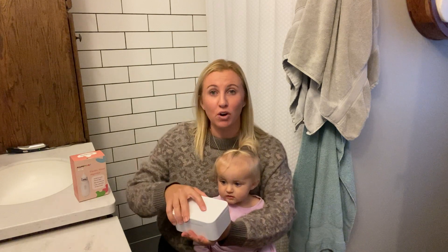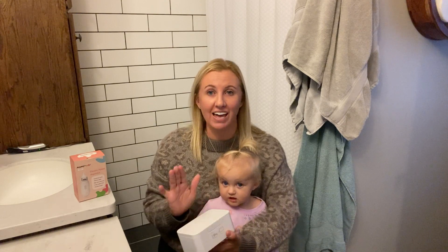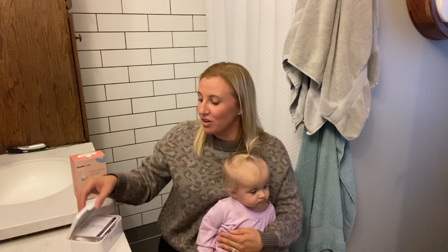It comes in this nice compact little case that's perfect for on the go or travel if you need to throw it in your diaper bag. It is super compact and it's really easy to take on the go with you.